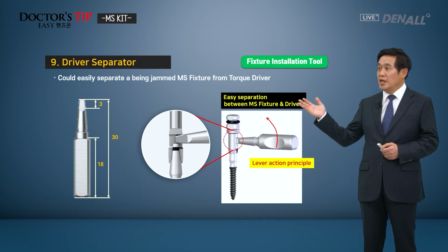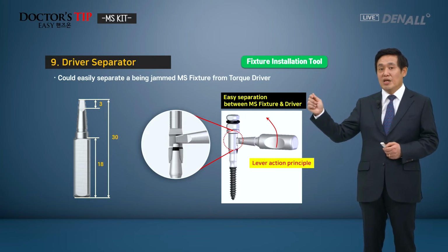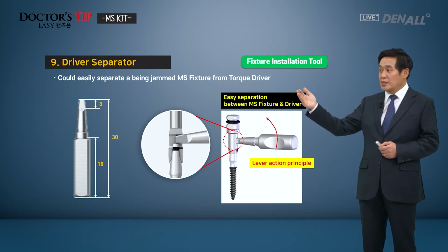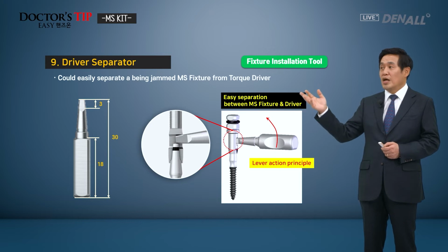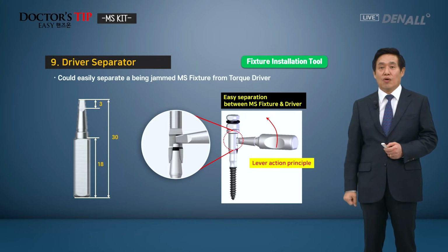And I said before, just in case, because it's a one body implant, if you have excessive torque, then the one body implant in the torque driver could jam. And in case you have jamming, if you try to forcefully take it out, the one body implant's initial stability can be broken. So for the separator, we have a special tool. If you have jamming, you just put it in and use the lever action principle, then very easily the fixture and driver can be separated. So that's how it's designed. So even if there's jamming, very safely, it doesn't hurt fixture stability.